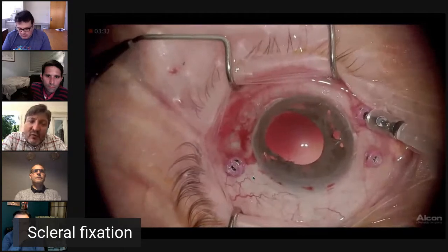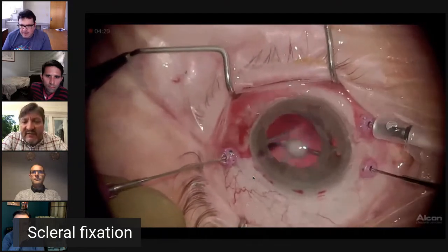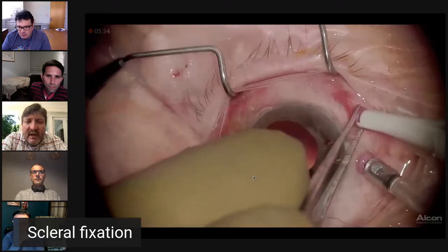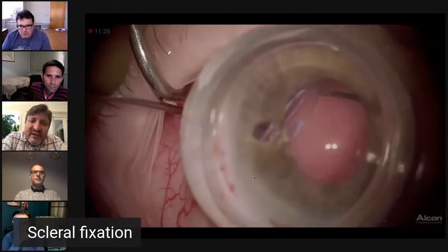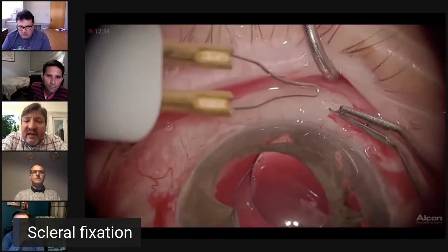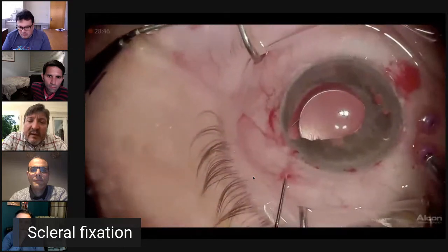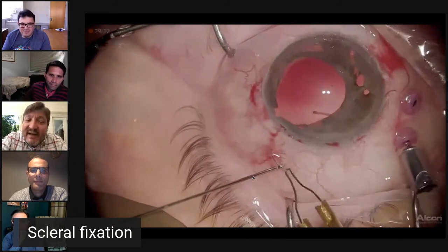So, of course, this guy's anticoagulated on Coumadin and on Plavix. So I'm trying to use a minimally invasive approach here. I'm 27 gauge. As you see, I get as much capsular material off to really expose the lens well. I change the bevel. I don't have the little thin-walled 30 gauge needles in this operating room, so I'm using the 27 gauge trocar. I pull it out. Now watch what happens when I pull the second haptic out. The first haptic gets pulled right back into the eye.